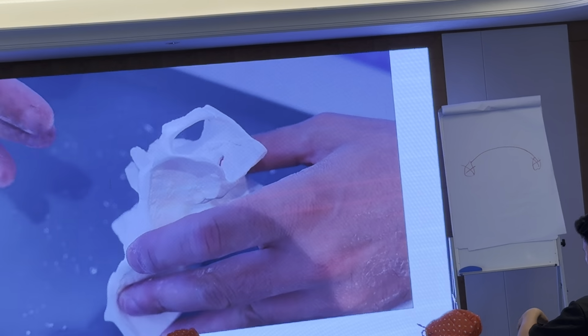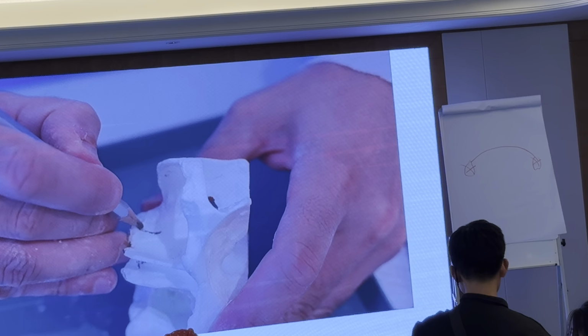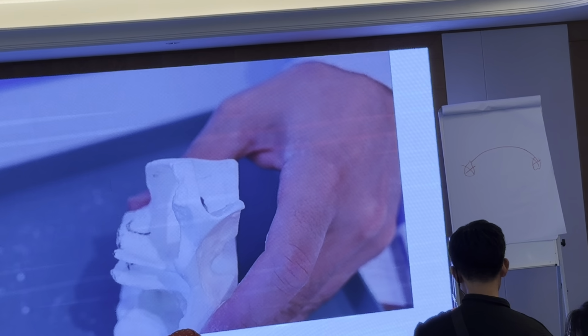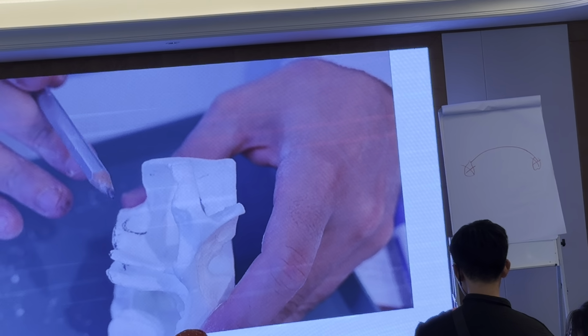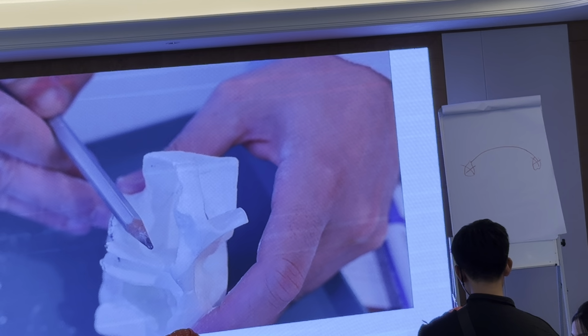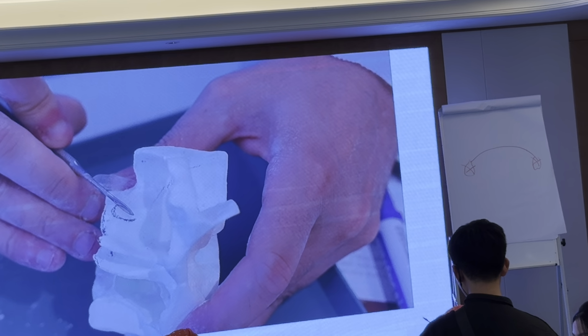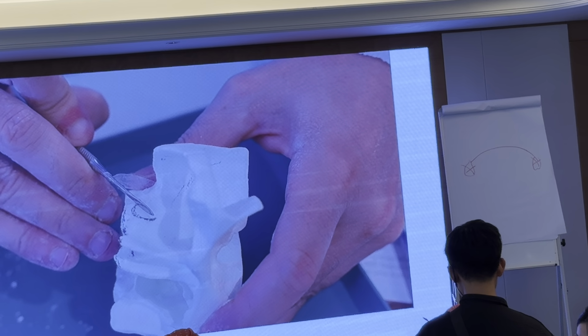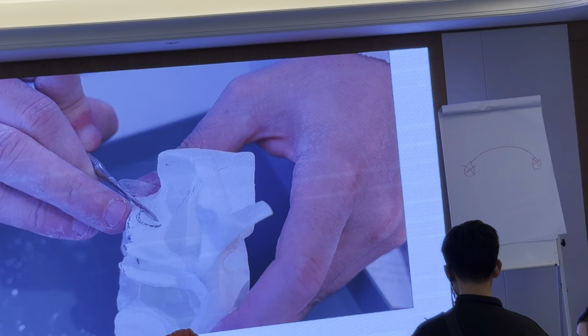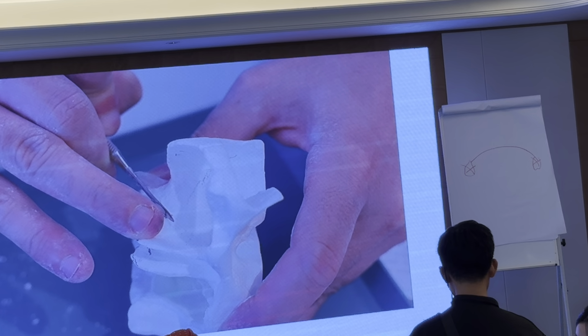Then, how do we decide our starting point? Let's imagine that the sinus is like that. Okay? So I tilt the slice, the view on the CBCT, and I go distal, this way. I go distal, and here with the view I see that I have some bone here, I'm inside the sinus, and then some bone cranial.